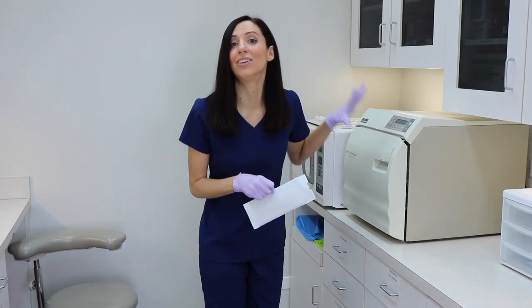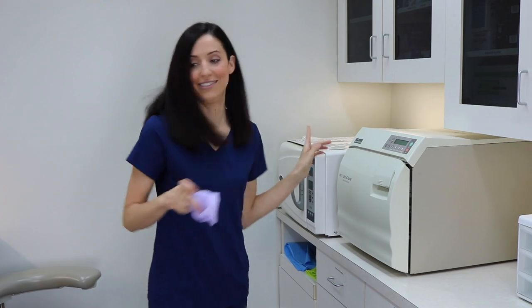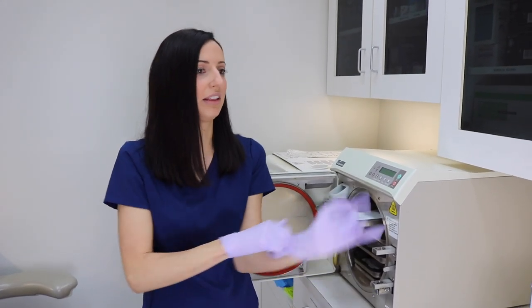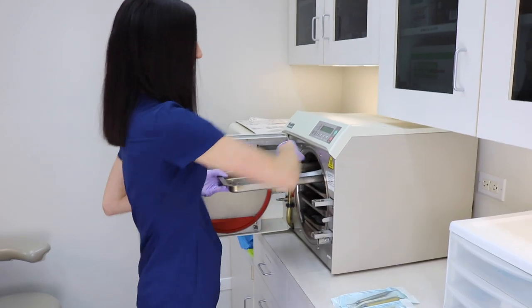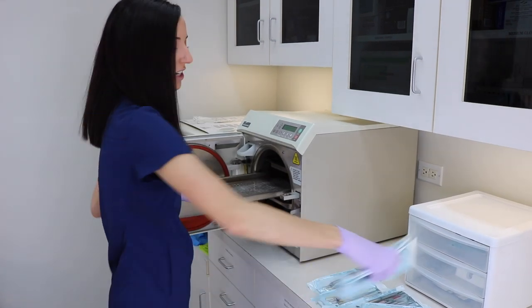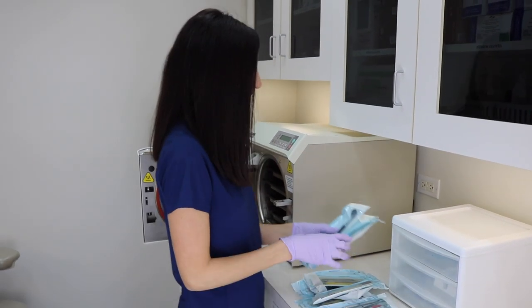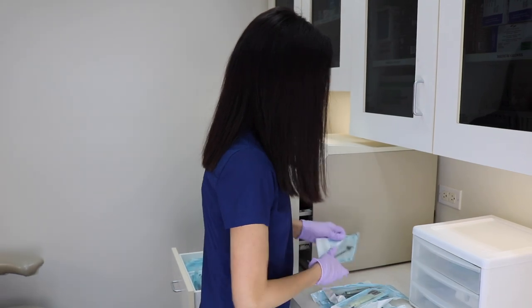Over here is where we load the dirty instruments into the autoclave — this is what actually sterilizes them. Before loading, I need to unload the clean stuff, which looks like it's still from yesterday. This is the clean area — very disinfected. We put all the clean stuff here to sort where it goes: mirrors go in certain drawers, hygiene kits go here.